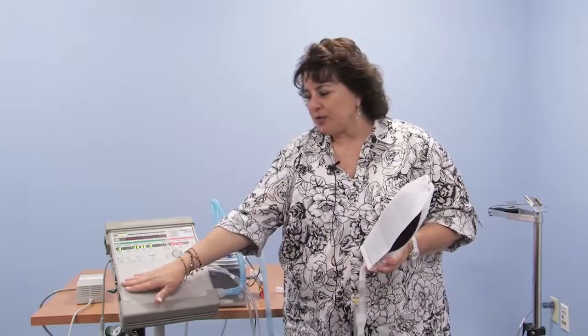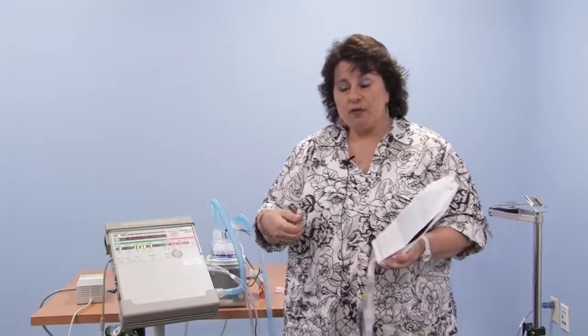Remember that the oxygen that goes in the machine is a fixed number, so you may add 3 liters a minute. But what if the child breathes like they're crying and they're anxious, or they're happy and playful and they're breathing much faster? They will dilute that oxygen. So they may need a little bit more flow from your oxygen source when they're very active and breathing faster. And in fact, at night asleep, they may not need as much.